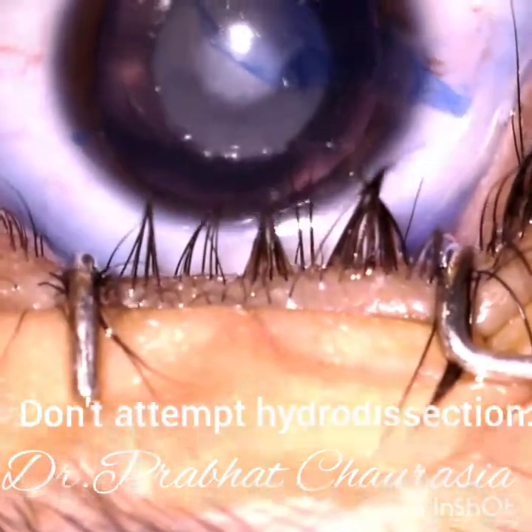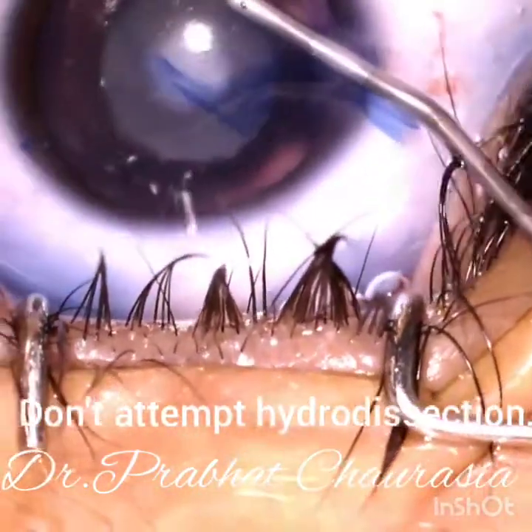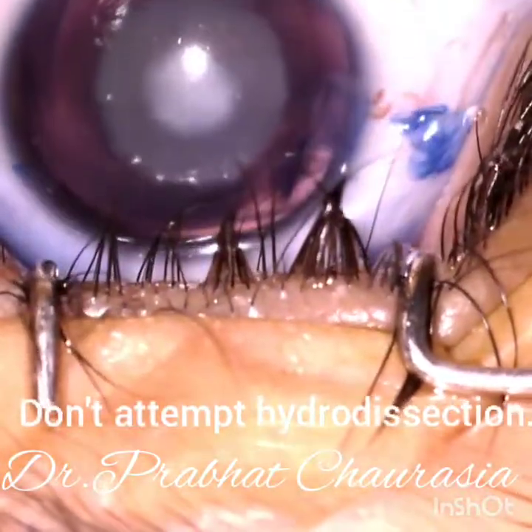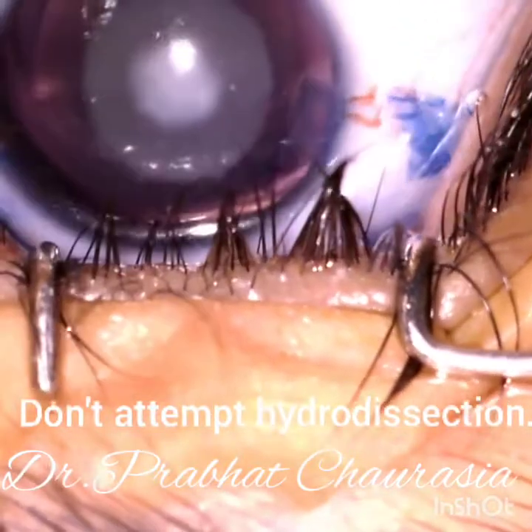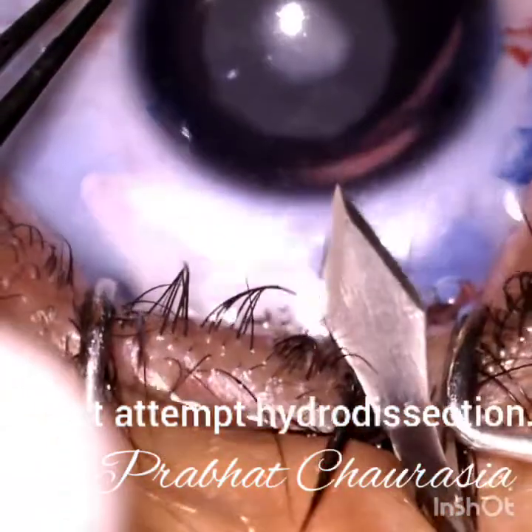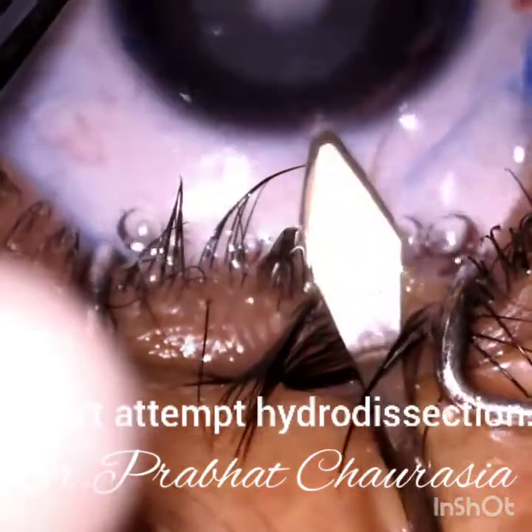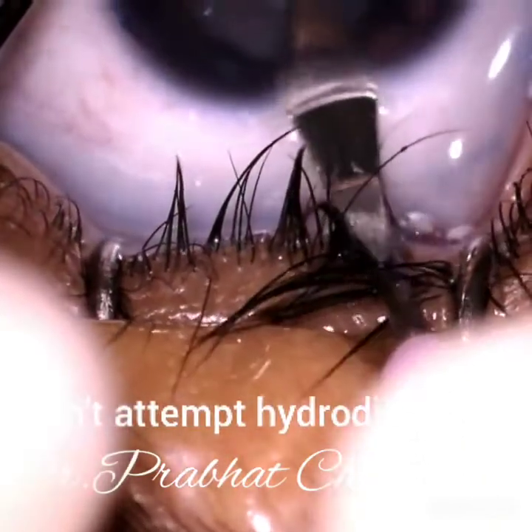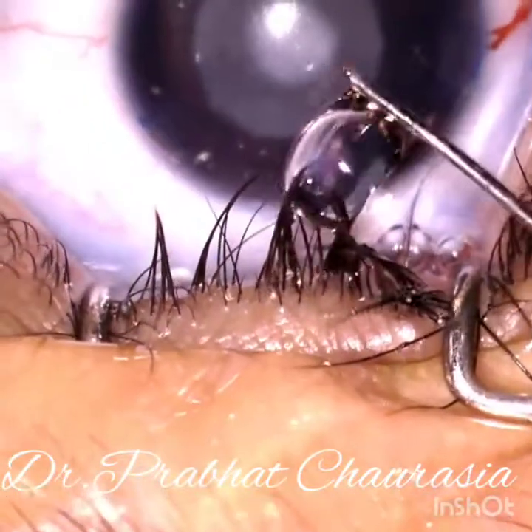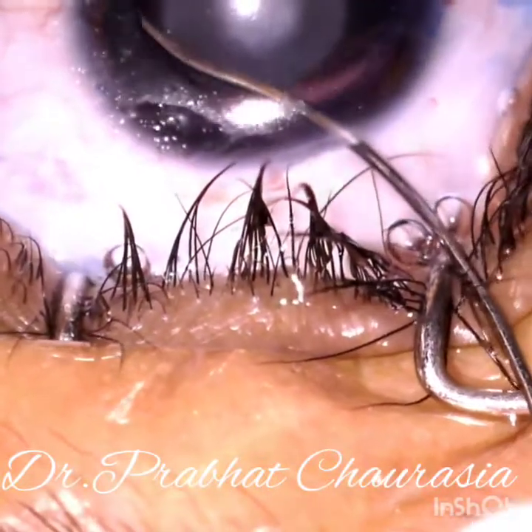It is a continuous curvilinear capsulorhexis of about 4.5 millimeter size. Now after making the rhexis, make the posterior limbal main port — this should be a triplanar incision — and then do the hydrodelineation.